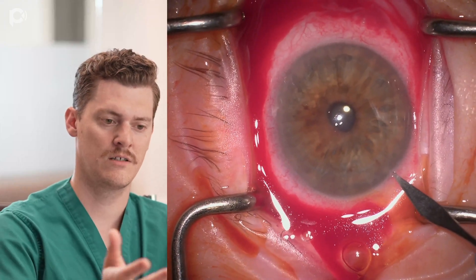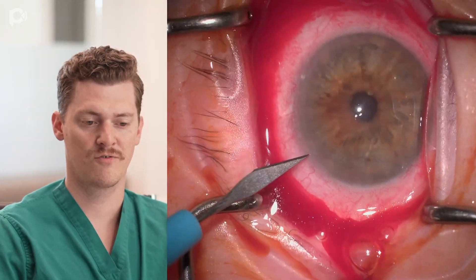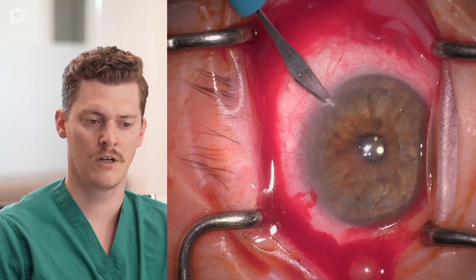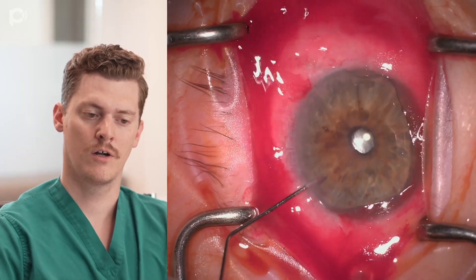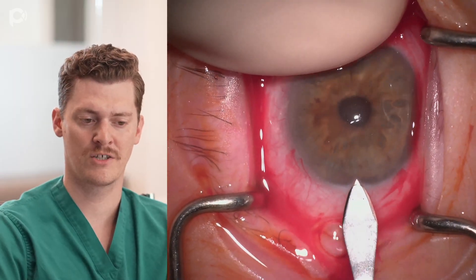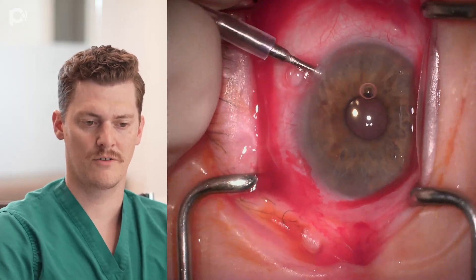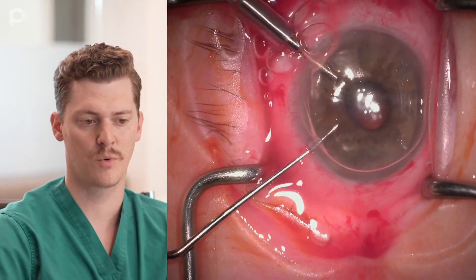Here we start DMEK. You can see the eye is already a little bit bloody — that's from a subtenons injection to help the patient feel more comfortable. I'm making three paracenteses: two mainly to work through, and a third one for our AC maintainer. You may notice the first paracentesis on the right probably could have been a little more inferior, where it isn't as close to the main wound. You can see the main wound and the right paracentesis being very close to one another, which will interfere during surgery and doesn't give an additional vantage point.